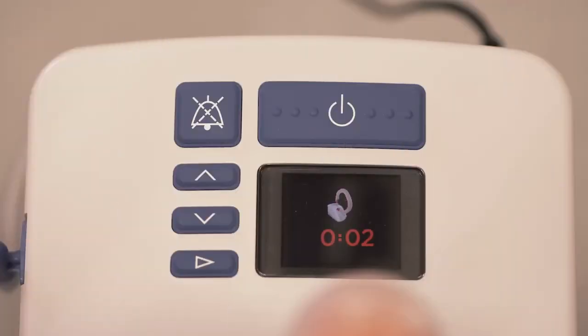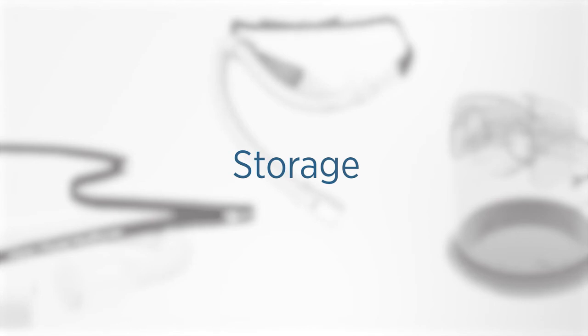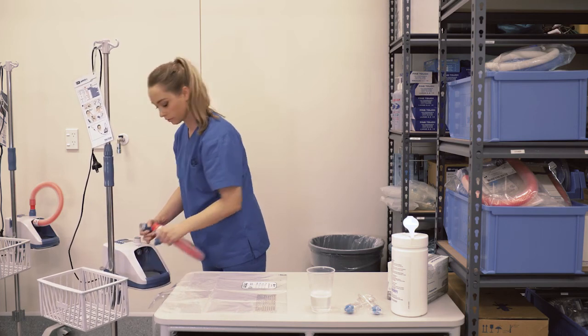Once the countdown reaches zero, the disinfection cycle has completed successfully and the disinfection number is displayed. Finally, turn the Evo2 off by holding down the power button. You can then remove the disinfection tube and seal the Evo2 with a clean storage cover.